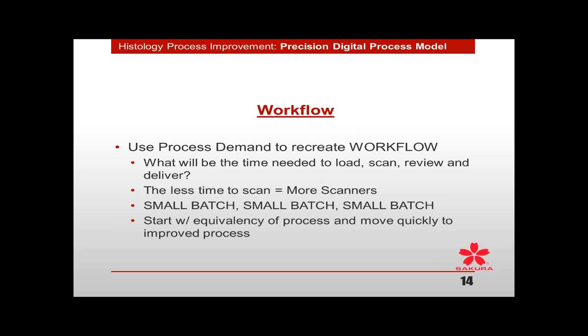Will you be able to load, if your workflow is possible, that you're going to be doing, we'll call it the pre-processing up through, say, your H&E staining, just your H&E staining if you're going to be doing that? When will you be able to load? Will you have the luxury of scanning throughout the overnight and then turning those out the next day? Do you have to scan throughout the day and turn out those results?